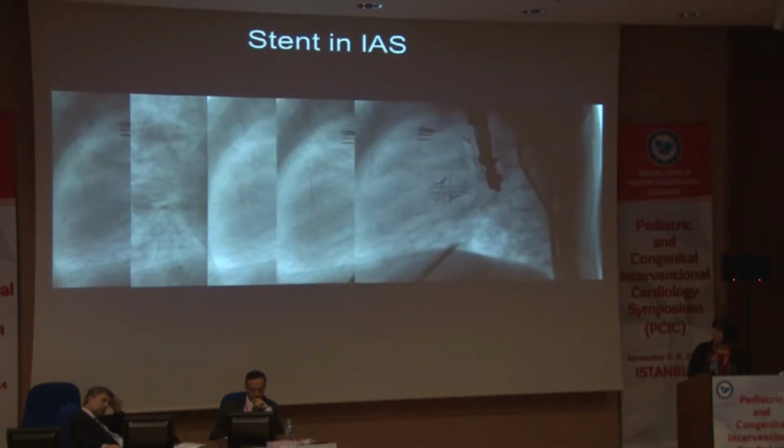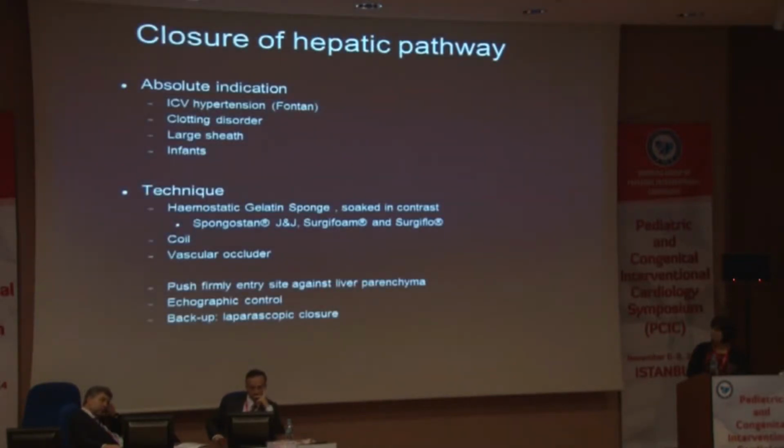And in the end, the position of your sheath is still in the hepatic vein. Now, which type of occlusion technique should one use? I think, well, in all the patients we do occlusion techniques, whether it's high risk or not. The technique is, there's a few possibilities.